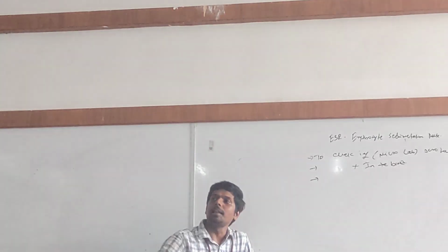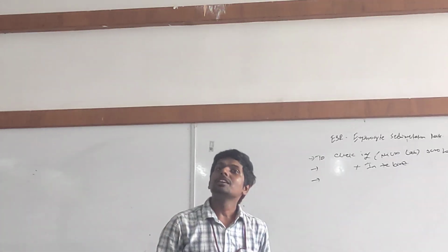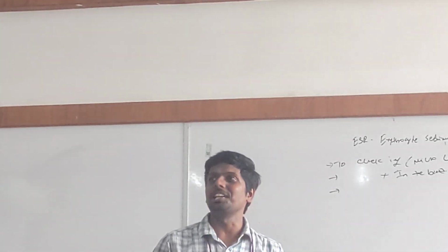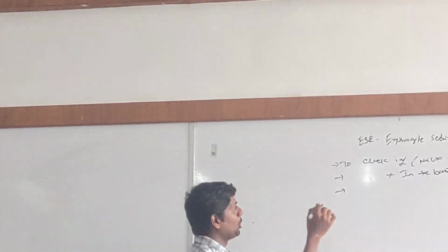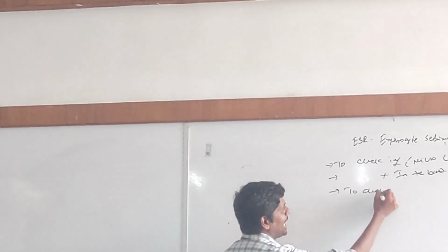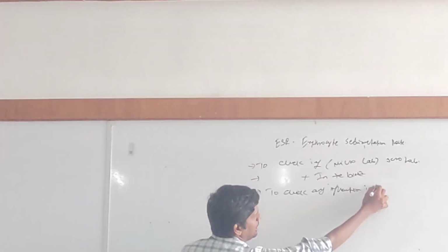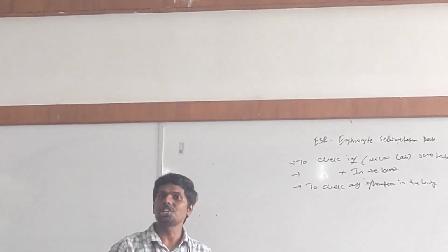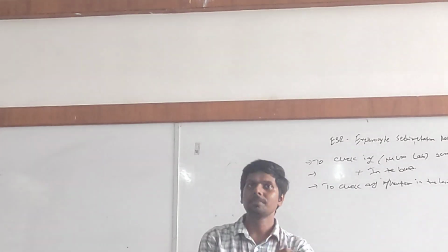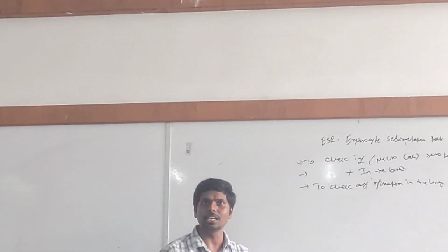Yes, Miss, what is your name? Chantal. Yes, Chantal, tell me. Very good. To check inflammation in the body. Everyone appreciate Miss Chantal. To check any inflammation in the body. So that is the primary purpose of performing ESR.